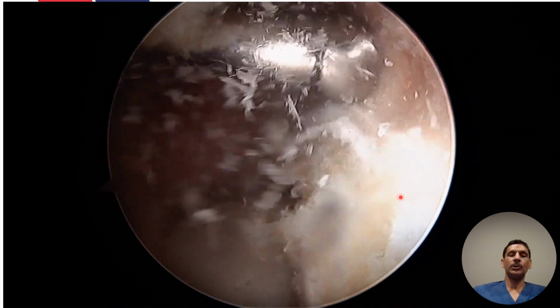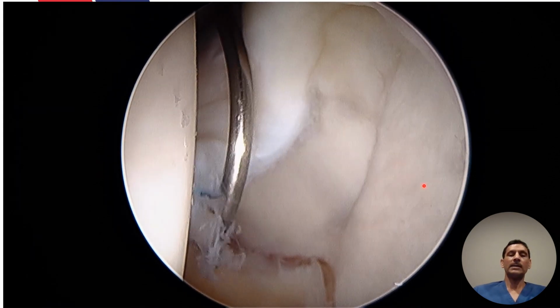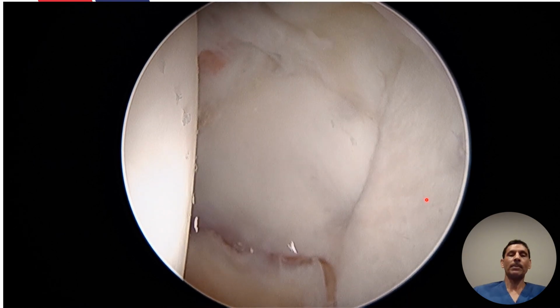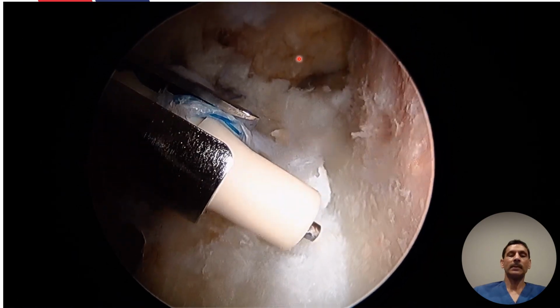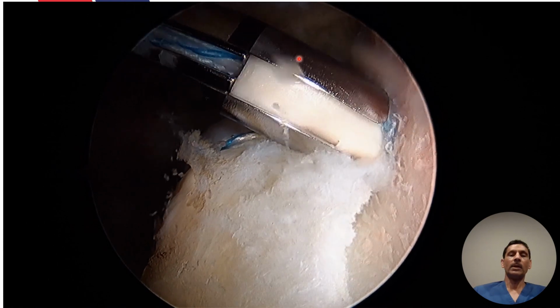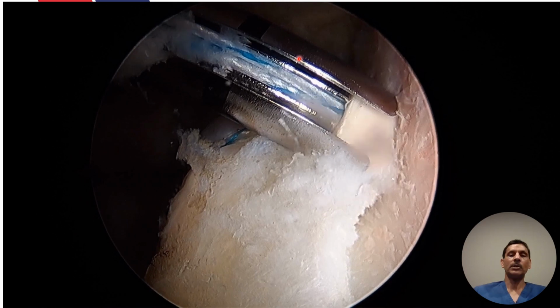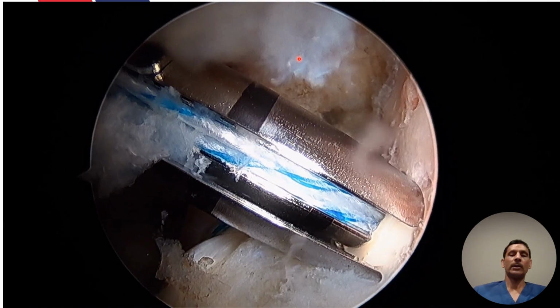So this is the labral tissue and this is the articular cartilage that's getting exposed. In this particular case, I did not excise that articular cartilage. I chose to wrap that cartilage and the labral tissue as one soft tissue mass and put it against the newly formed rim. We recessed the rim back by about 5 millimeters, so we're putting all the tissue back to that rim. There's a suture anchor.